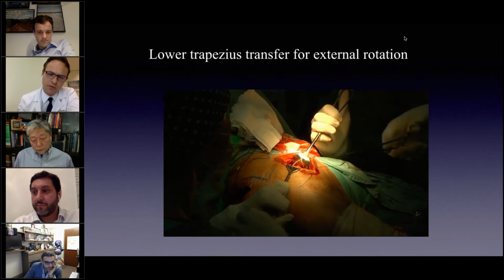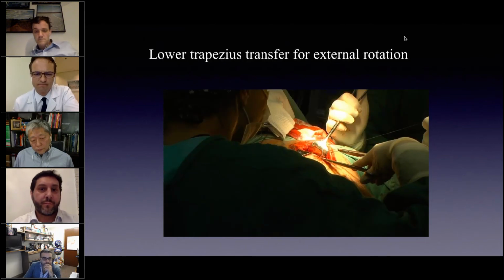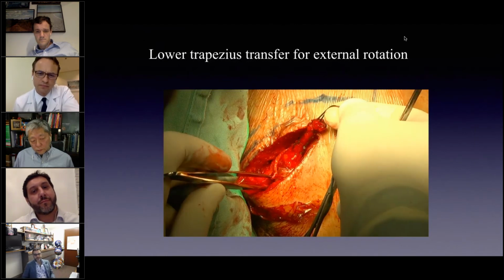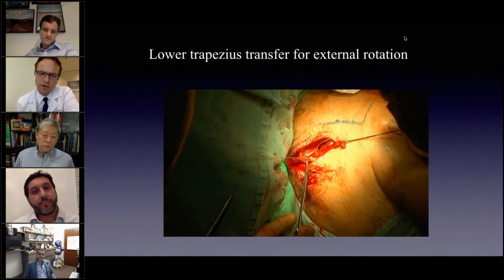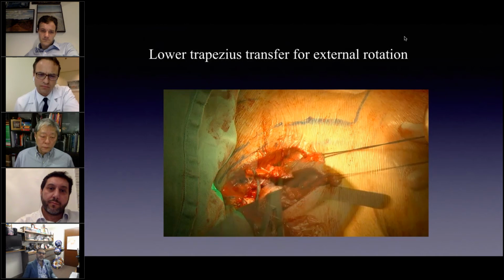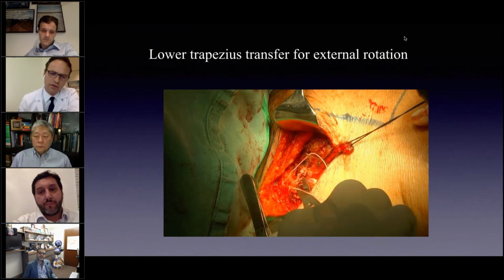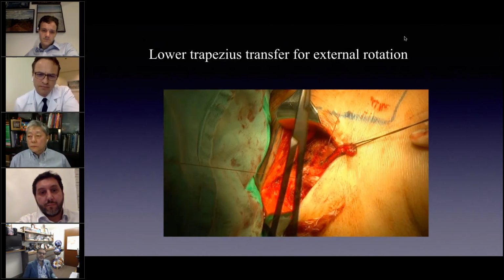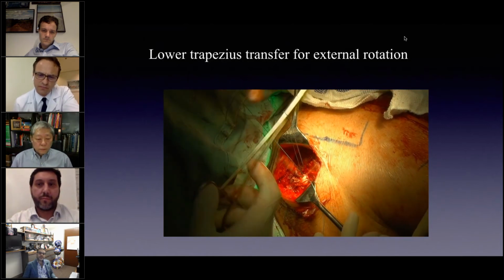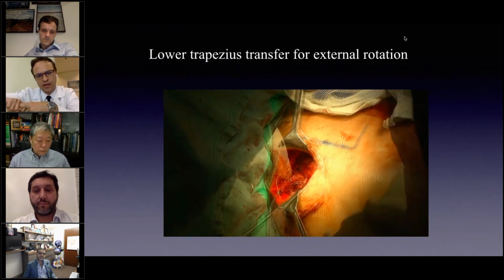We can do some stitches around the graft and the cuff to do like a tenodesis effect. Then we can hold the trapezius with the hamstrings. It is a very important step. We have to do very tight and heavy sutures. Putting sutures with trapezius and hamstrings. Then I bend the trapezius and suture it to itself like a chain.